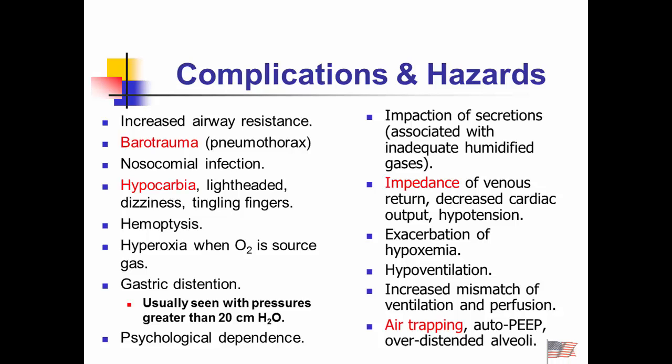You can also see air trapping happening, and we see this in patients who have airflow limitations, say COPD or asthma. We don't allow enough time to exhale, they trap the gas. And that can lead to really, really huge problems, as we'll talk about later.